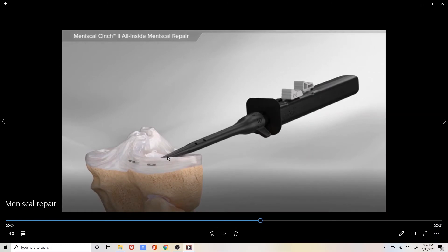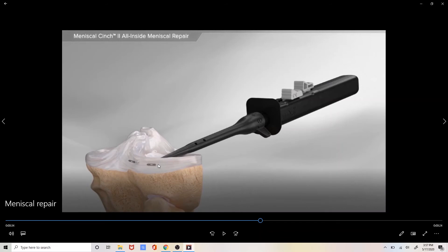The meniscus is penetrated in two separate locations with the needle from the meniscal repair device. The device then deploys these two small soft tissue anchors that are placed up behind the meniscus to anchor the suture to the tissue.